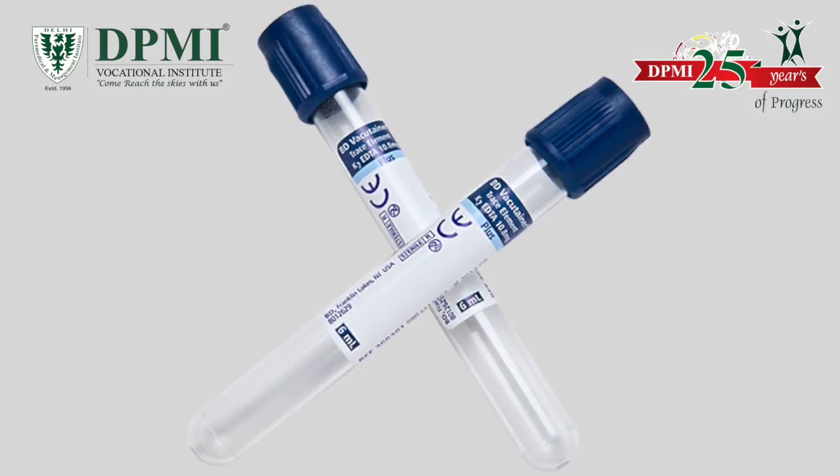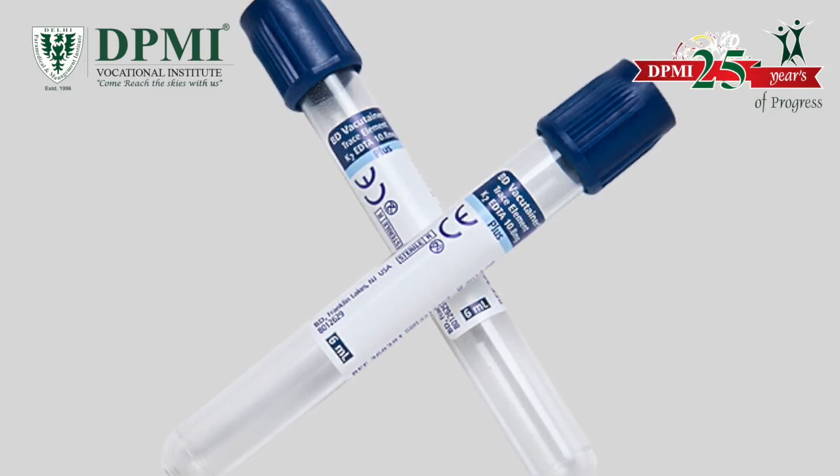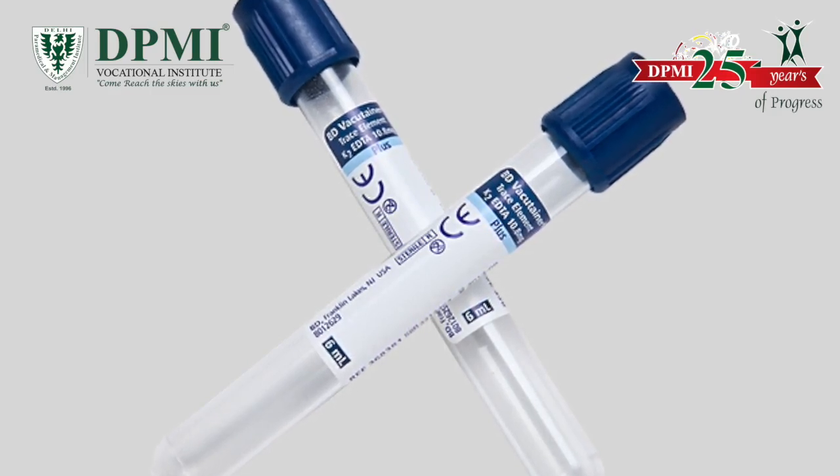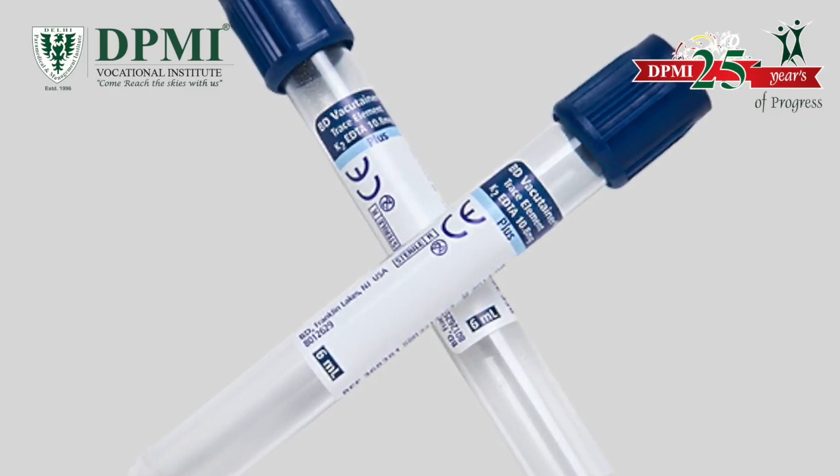Dark blue top. These tubes contain added anticoagulant sodium heparin or EDTA as an additive. These tubes are primarily used for trace metal analysis and toxicology tests.